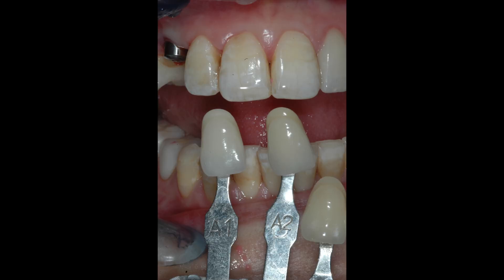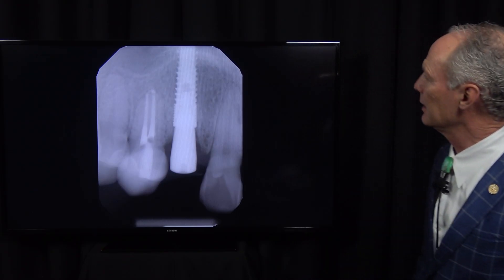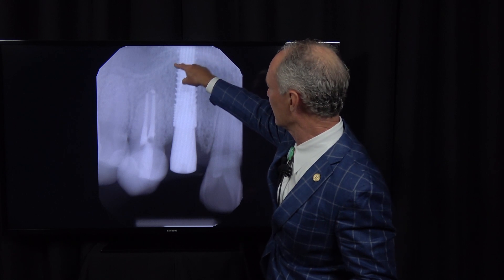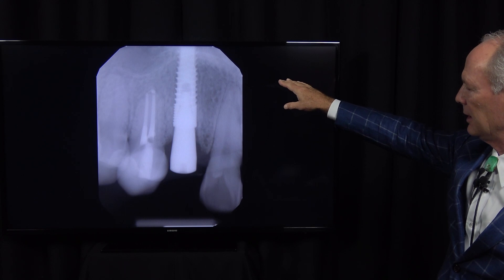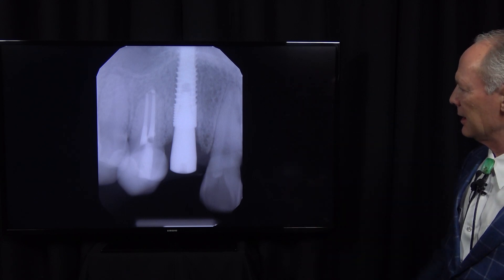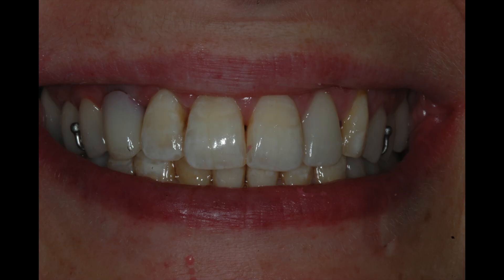Taking a shade for the laboratory. Here's the healing abutment in place. You can see the implant is ideal — just barely into the floor of the sinus. That's perfect because you're using the cortical bone in the floor of the sinus to stabilize the implant. There's the provisional restoration with the ball-clasp flipper.